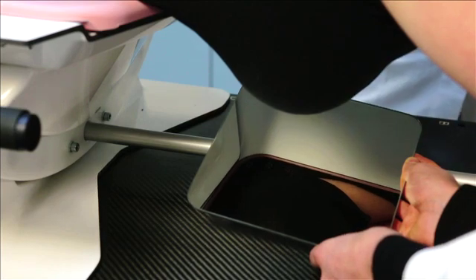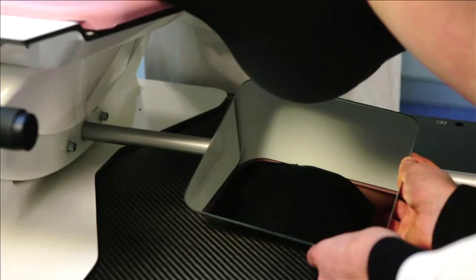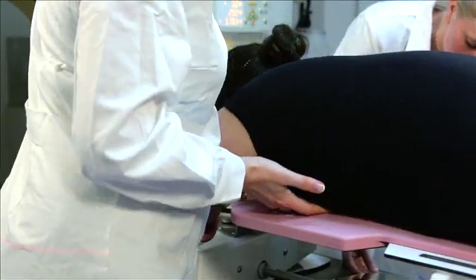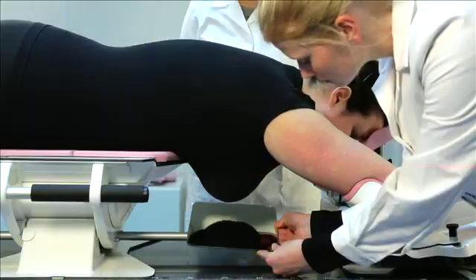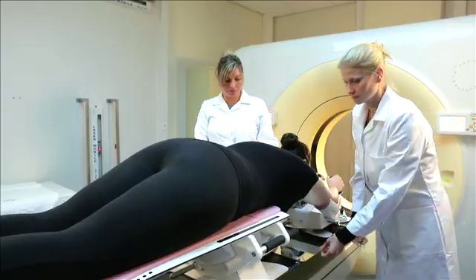Reposition the patient laterally while another person looks in the mirror underneath the breast bridge to check if the sternum is positioned at the edge of the breast bridge. While repositioning the patient, pull the contralateral breast to the side of the board away from the ipsilateral breast.